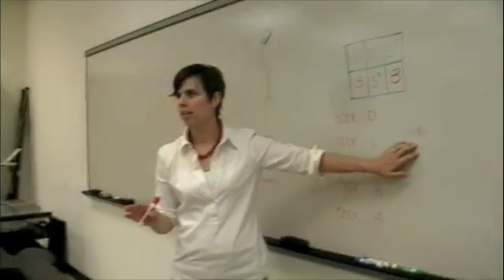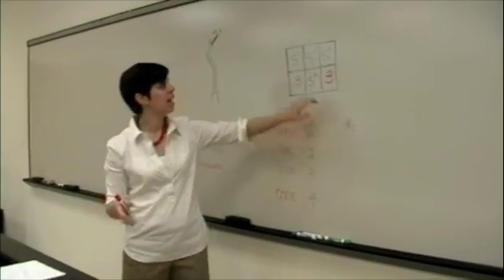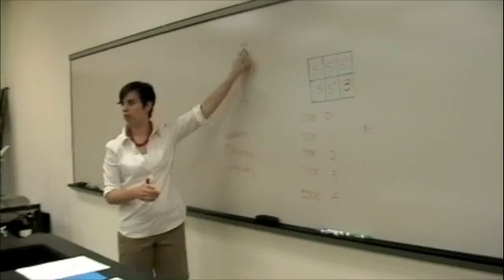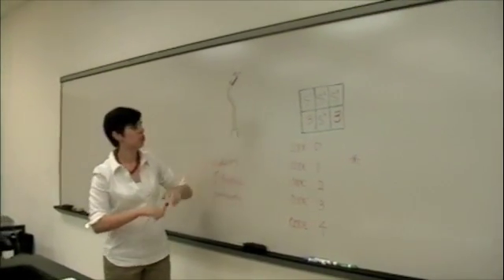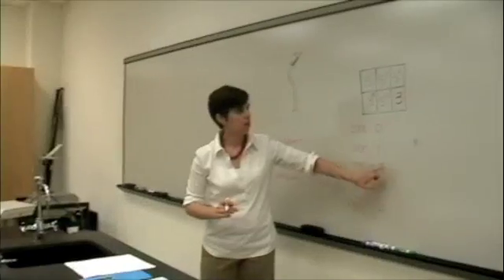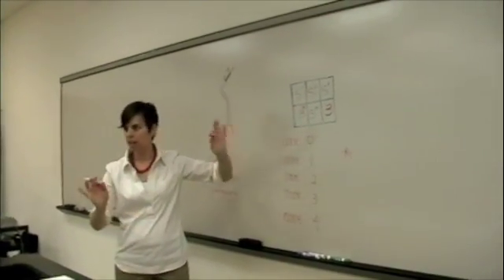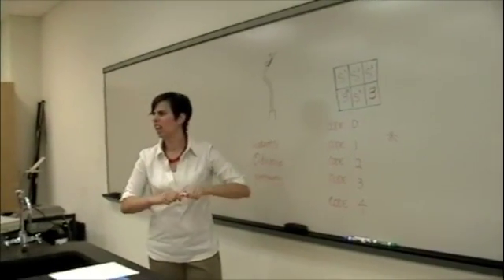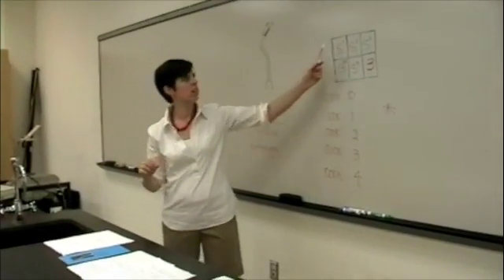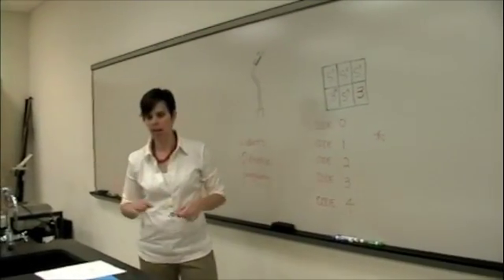Asterisk is if you've got somebody who has recession, mobility, furcation. If the recession measures at least 3.5 millimeters or more, you just put an asterisk in there, like that. That's just indicating there's something else going on in that sextant. If you get a code 3 with an asterisk, again, you'll probe the entire sextant. Same kind of thing. So that's what that is. And usually I like to make notes next to it anyway.